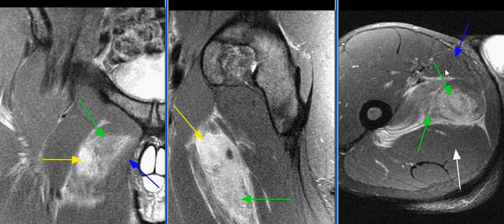The adductor brevis muscle lies between the more anteriorly located adductor longus muscle, as seen on this image with the blue arrow, and the more posteriorly located adductor magnus muscle. MRI findings are consistent with an adductor brevis muscle tear.